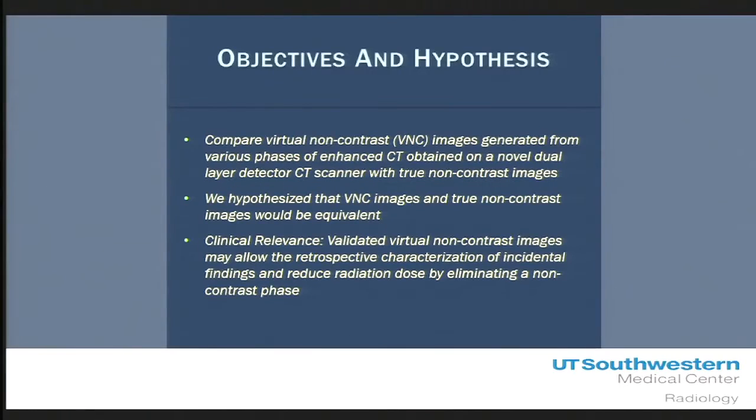So the objective of the study was to evaluate virtual non-contrast images generated from contrast-enhanced phases on a novel spectral detector CT scanner compared with true non-contrast images. We hypothesized that these virtual non-contrast images would be equivalent to true non-contrast images. Why this is potentially important is that virtual non-contrast images could be useful in evaluating incidental findings seen on contrast-enhanced CT, and also potentially reduce the dose in multi-phase exams where dose can be an issue.